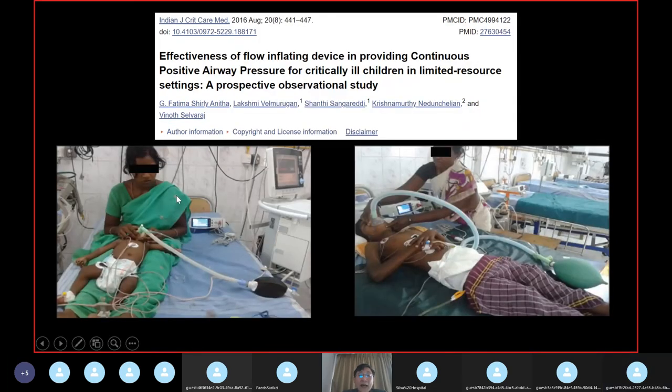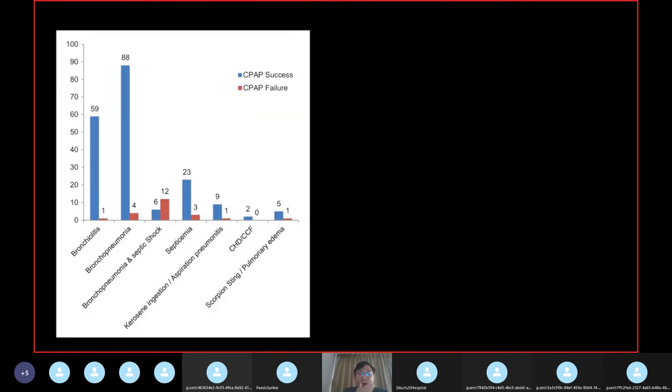This is what people do. The mother is asked to hold the mask to the child, and similarly here, the mother is instructed to hold the ventilation. And quite surprisingly, when you look at the monitor, wow, they are using a very expensive type of machine. You see the ventilator they use, a Servo-U. Not too bad, although they say they are a poor country, they do have a lot of nice machines. So what's the outcome?